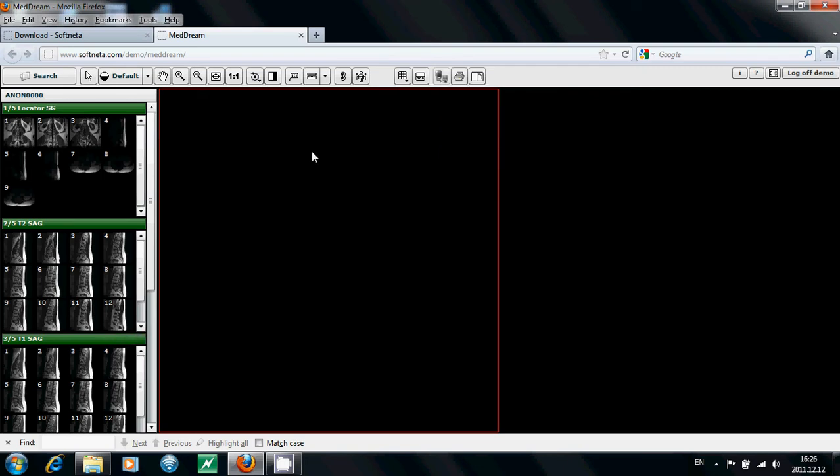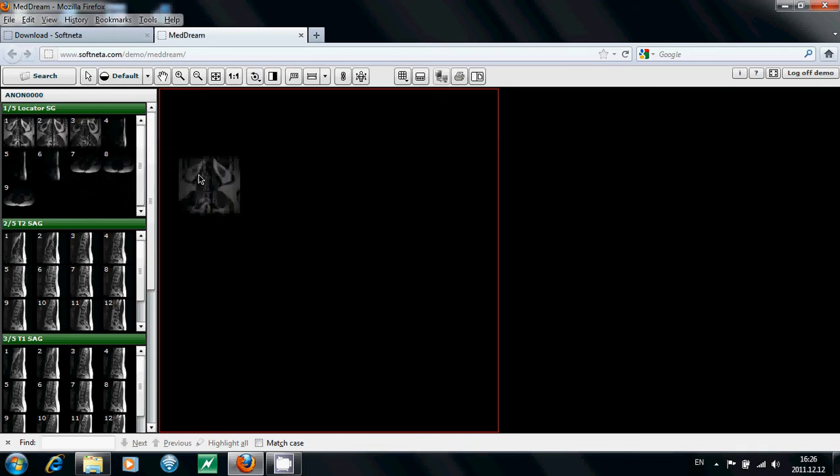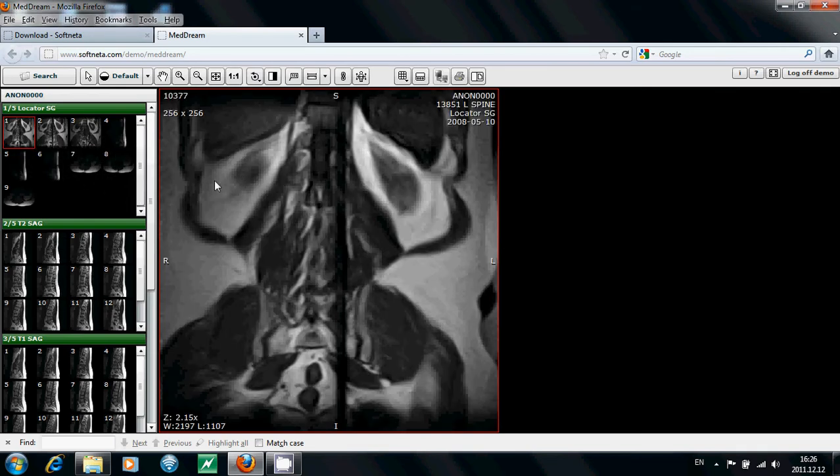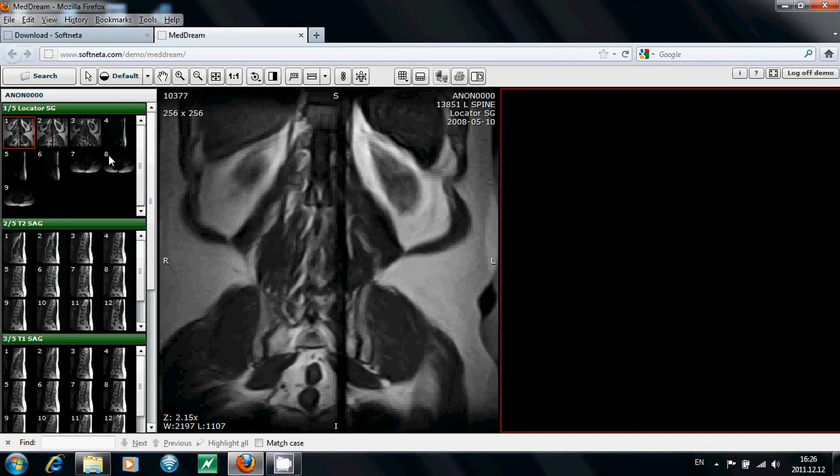In order to review your image, you have to move it on the pane. You may do it in two ways. Firstly, drag and drop it into the pane. Secondly, select the pane and double-click on the image.